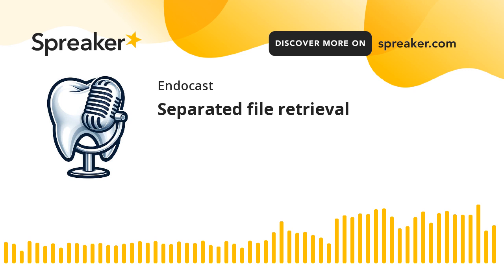In grasping we rely on two main techniques, either using a microtube or a wire loop. For the microtube, we can use a trephine bur. A micro trephine bur is hollow from inside, going above the separated file, preparing a circumferential 360 degrees space around the file. After that, we get a tube, the same size as the trephine bur. The tube has a pin or a very fine needle, which tightens the space around the separated file. This way, we grasp the file and can pull it.